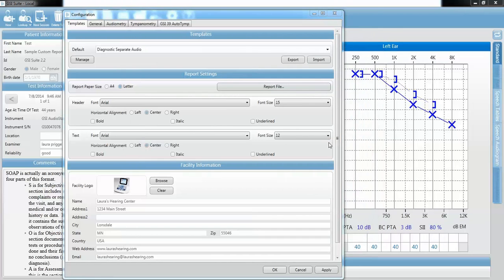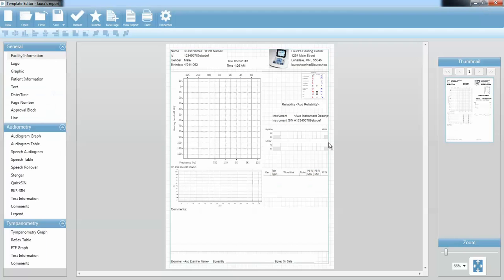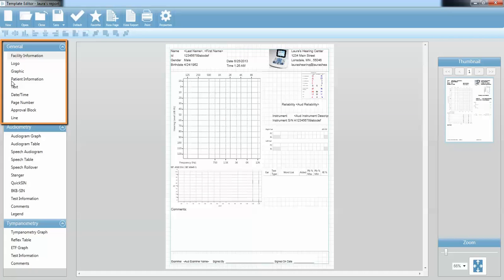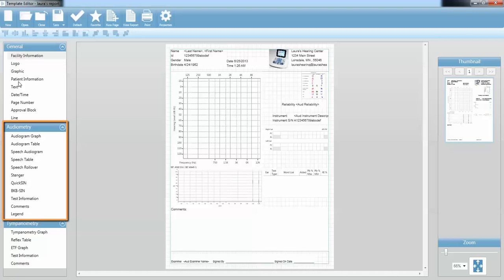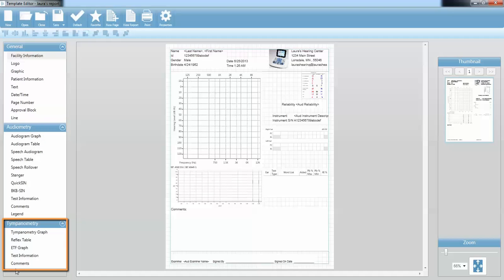When you double-click on a User Defined or an Editable Report template, it will bring up the Template Editor sheet that looks just like this. In the Template Editor, you have all of the components that were on that copied template, plus some additional information. Over here on the left side of the screen, this is where you'll find your components to include in your report. The General section contains general information pulled from the GSI Suite — facility, logo, graphics, patient information. The Audiometry section components are pulled from the AudioStar Pro or the Audiometry module of the GSI 39, and the Tympanometry section components are pulled from the TimpStar or the GSI 39.